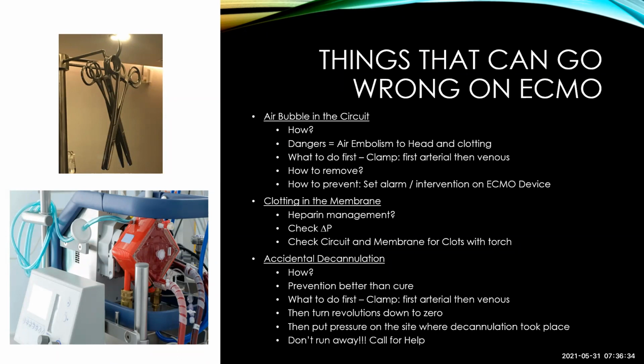And then you've got a perfectly well patient that would have been decannulated in a proper fashion the next day, or could have come off ECMO, and now you've got nothing. So be sure that you keep your eye on the patients when they are close to coming off, because these accidents actually happen when they are very awake.